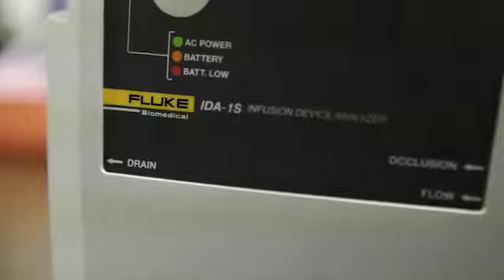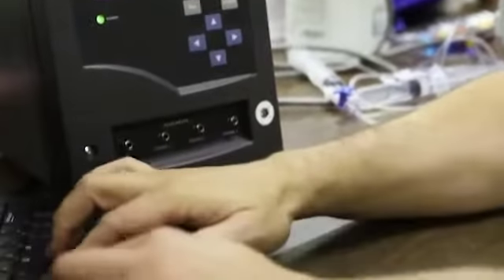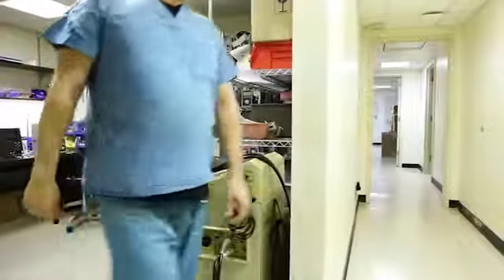I always think of the biomedical field — they move with technology. And these days, technology goes so fast. It's probably the most advanced infusion pump equipment that I've used so far in my career. It makes your job way easier. I love it.